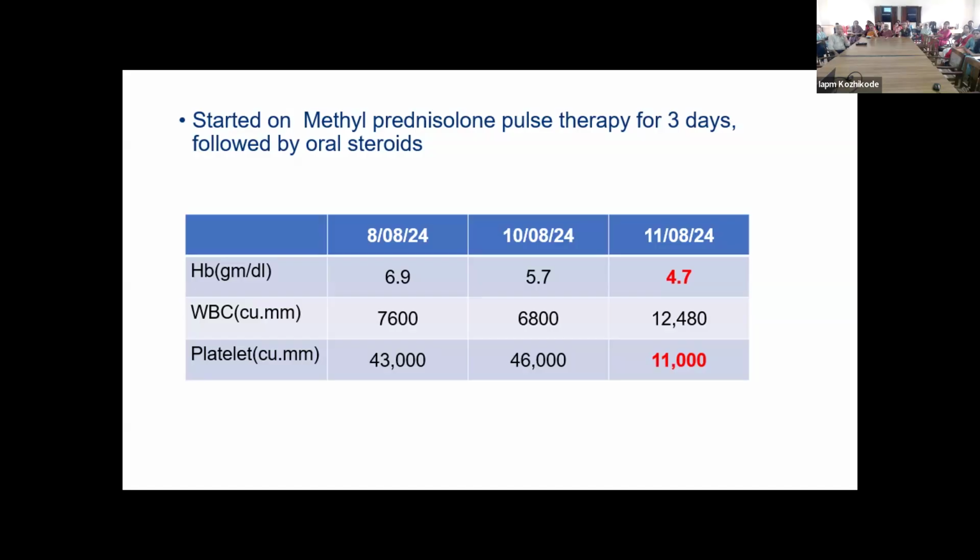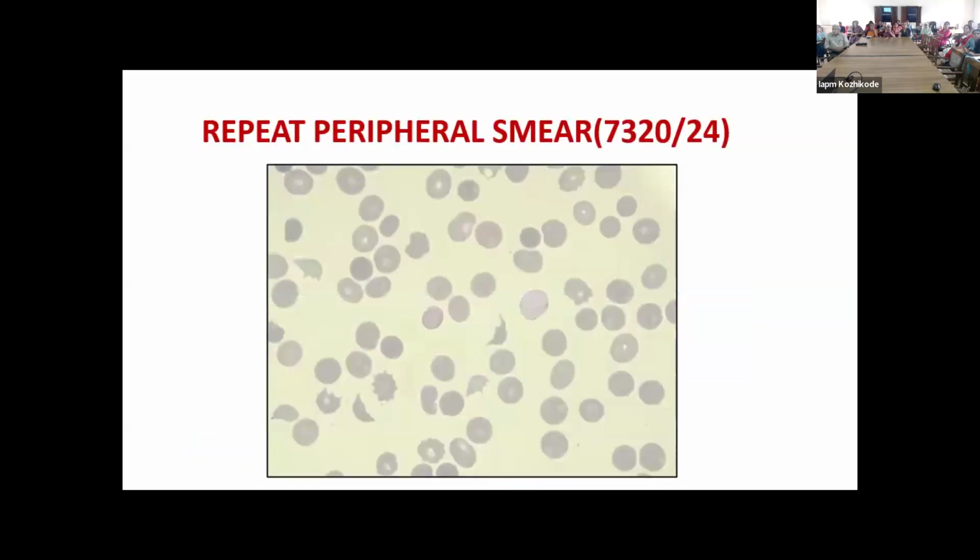So they reconsidered the diagnosis, because most autoimmune hemolytic anemias improve on steroid therapy. They also worked up for any hematological malignancy. They did a bone marrow study because the patient had bicytopenia. Bone marrow imprint shows mild erythroid hyperplasia. Along with bone marrow, they also sent a repeat peripheral smear, which shows anisopoikilocytosis and marked fragmented RBCs, seen 5 to 6 per oil field.